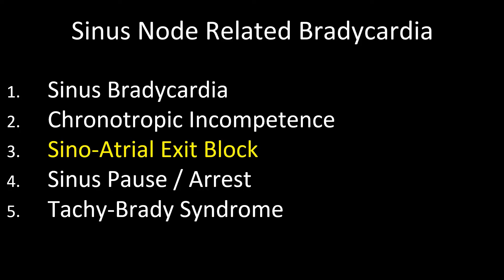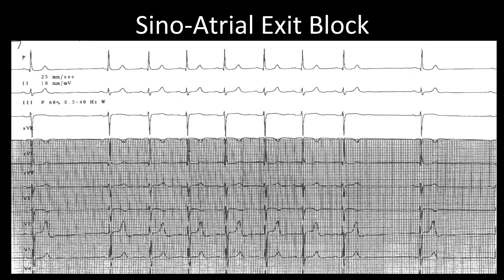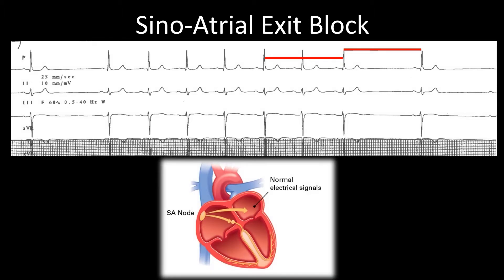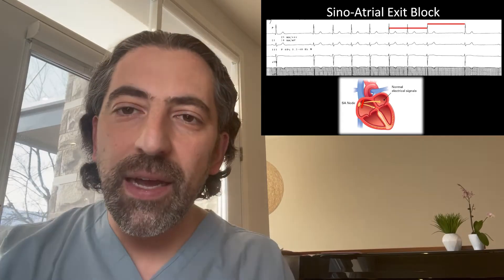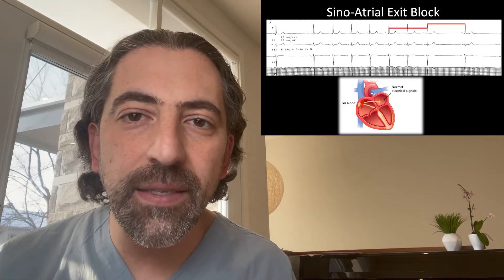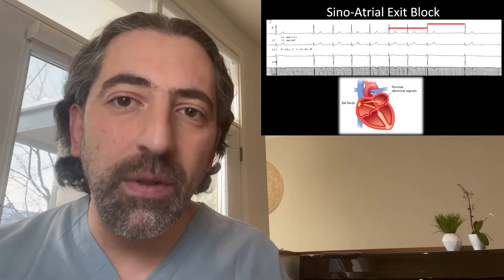The third sinus node-related bradycardia is sinoatrial exit block. In this case, there are periods of normal sinus rhythm, but then there's a dropped P-wave and a dropped QRS, generating a QRS-to-QRS interval that's exactly double the normal QRS interval. If we place our calipers between two normal QRS complexes, there will be an exact match to the two beats where there's a skipped complex in the middle. What's happening is that depolarization takes place at the sinus node, but due to scarring or fibrosis, the signal is blocked from exiting. The next signal exits on time, which is why the interval doubles. You can also get tripling of the interval episodically.